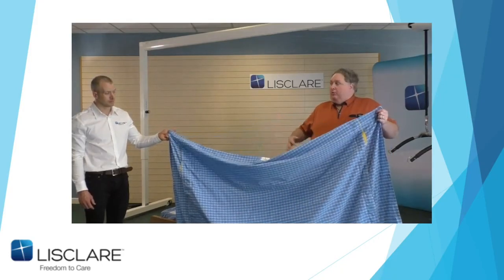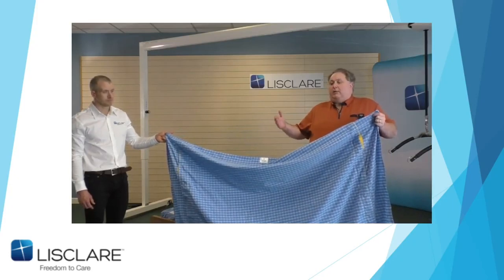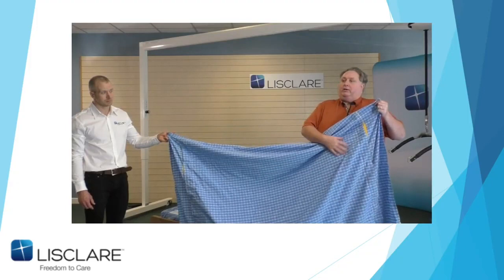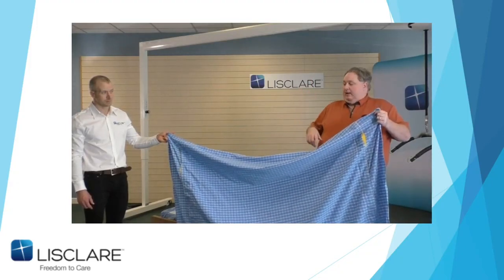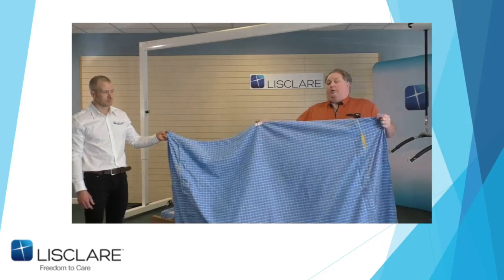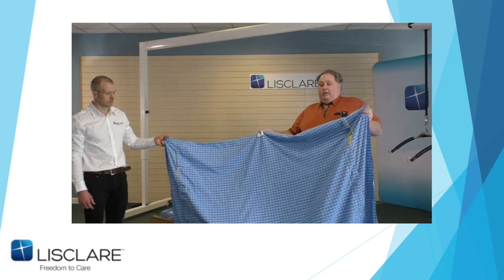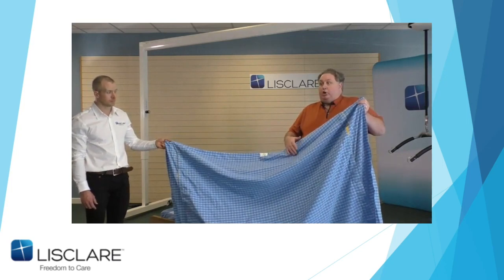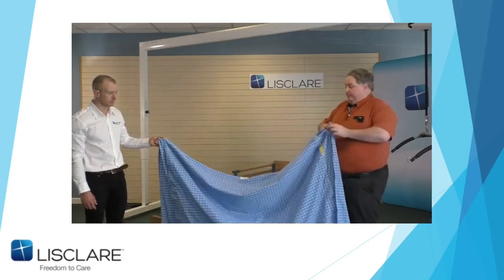And it means that it's always underneath the torso because I've very rarely used the full length sheet in a bed because I've always wanted the heels to be away from the friction area, especially for spasms and moving the patient up and down when you're profiling the bed. And that's one of the reasons why training's involved in this a lot, to make sure that people understand that. That's why we actually even pressure mapped it to show, because I was trying to keep the patient's heels free.